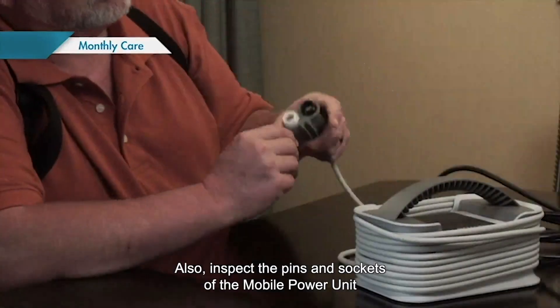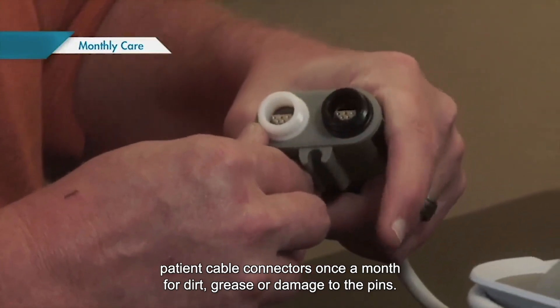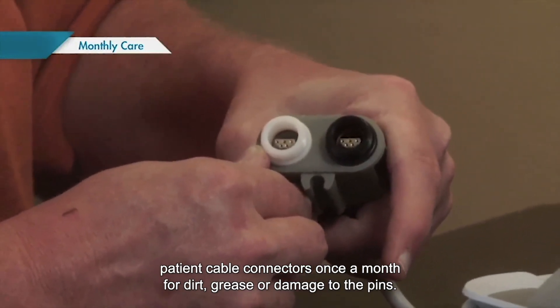Also, inspect the pins and sockets of the mobile power unit patient cable connectors once a month for dirt, grease, or damage to the pins.